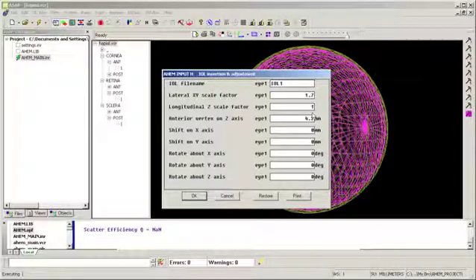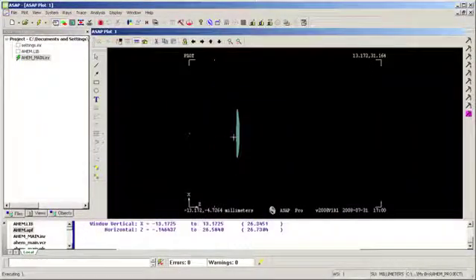I can stretch it on the Z-axis. Here I'm just keeping it the same. I can position its anterior vertex, and I can do various other rotations or shift on that intraocular lens as well. I click OK, and it's running. Draws the graphic.